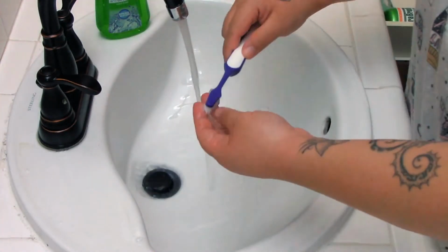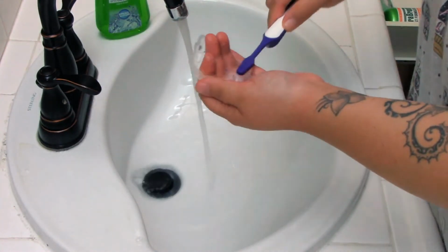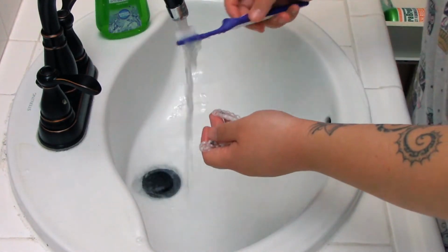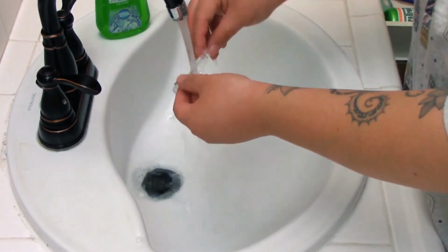If you guys skip this step, you'll find that your trays are a little cloudy looking or dirty, so I definitely like to keep them clean. And then I'll keep them in my little container while I go eat breakfast.